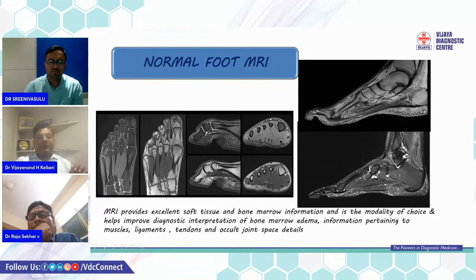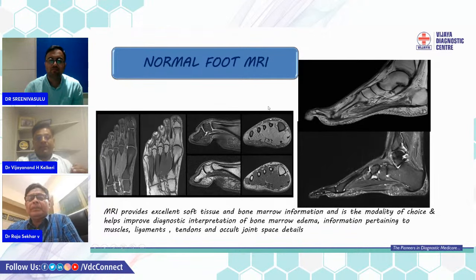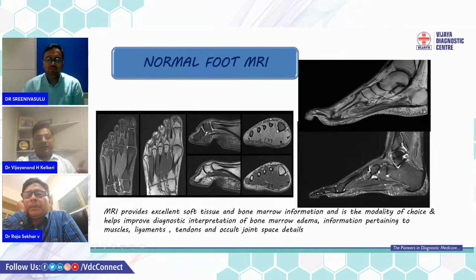This is showing the great toe with the interphalangeal joints and metatarsophalangeal joint. And this is the axial image taken at the level of the midfoot or anterior or posterior forefoot, you can tell, wherein you can see all these metatarsal heads, and then you can see all the muscles very clearly.